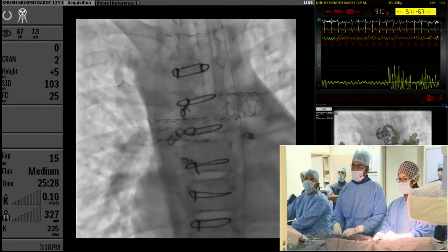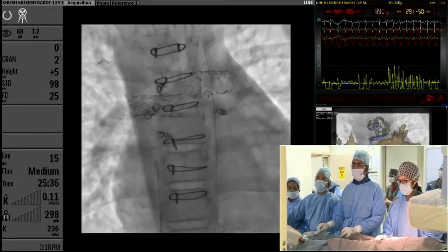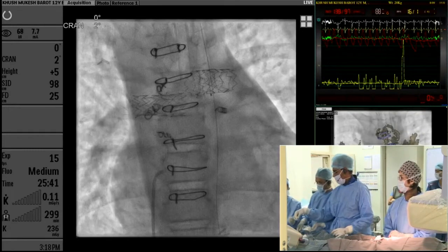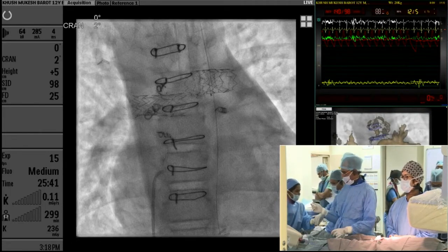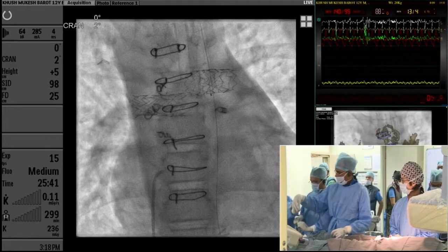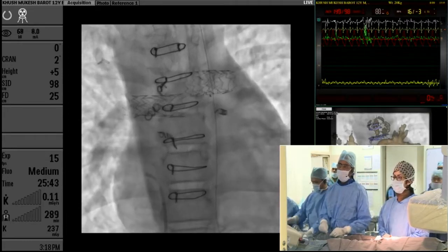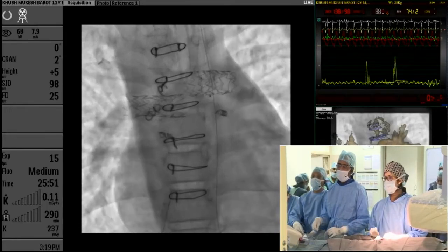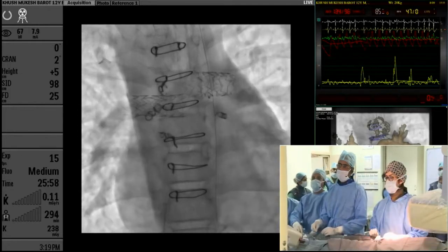Exactly. Now, Shiva, one comment I wanted to make. Show the heart. Yes, Doctor. The comment I wanted to make: when you did the right pulmonary angiogram, the right pulmonary artery appeared as if there was some vascular disease. I'm not 100% sure. That could be one of the reasons for the pressures not completely normalizing even after adequate dilatation of the proximal PAs. My question is whether these are patients who also require pulmonary vasodilators after you have adequately dilated their proximal stenosis? The right pulmonary artery doesn't look very normal even in its distal arborization.